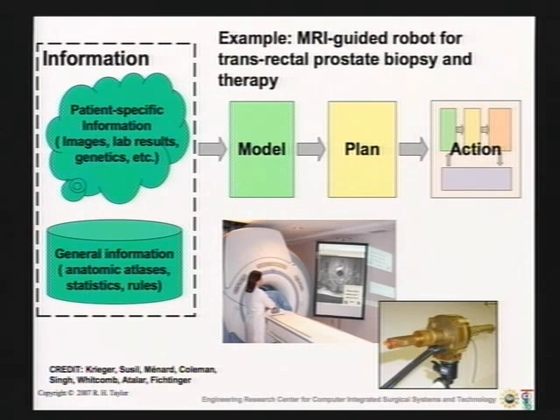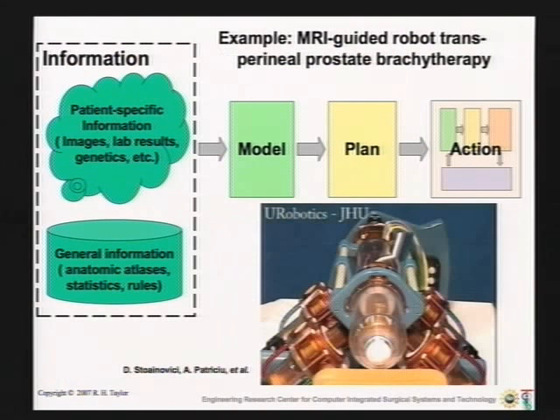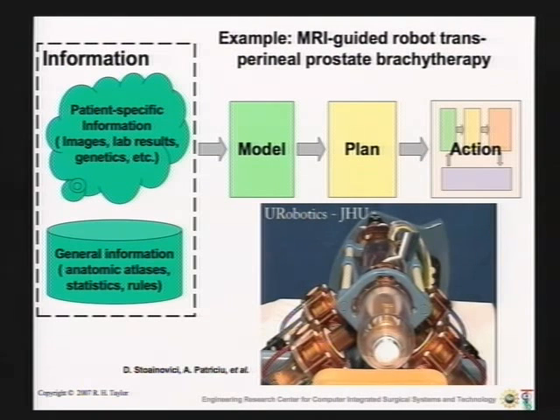Moving up the technology scale, I suppose, although the robot is mechanically much simpler, this is a system for in-MRI transrectal prostate biopsy that's been in use down at NIH. It was developed by these folks here. Axel Krieger and Rob Susel are the two main people behind the robot. Here's another robot that Dan Stoyanovich did for, again, in-MRI needle placement.